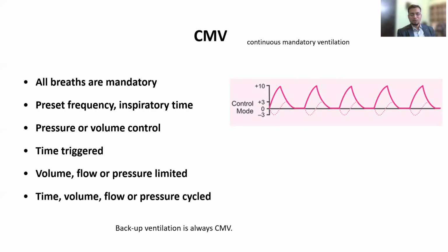However, CMV mode is associated with profound diaphragm muscle dysfunction and atrophy. Therefore, it is no longer the preferred mode of mechanical ventilation. This mode is still used in paralyzed or sedated patients in the operation theater, and sometimes also in transport mechanical ventilation.